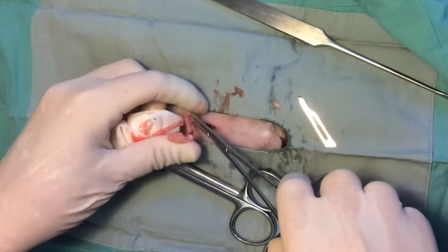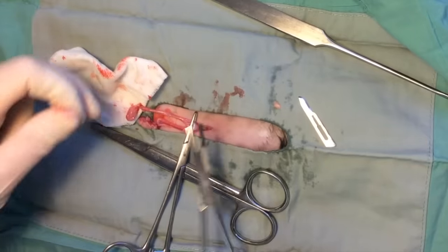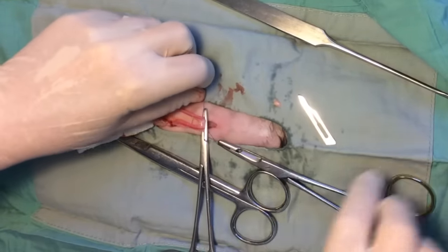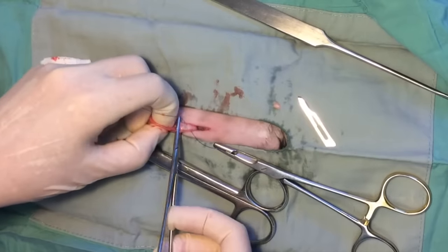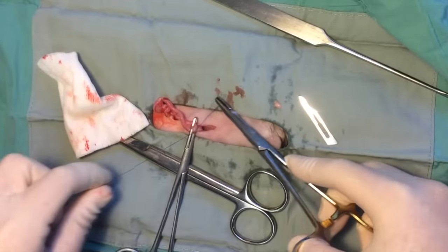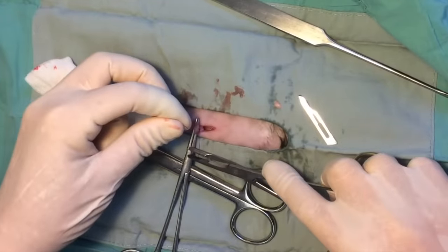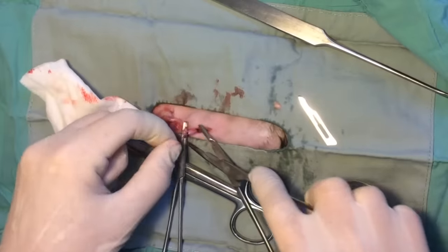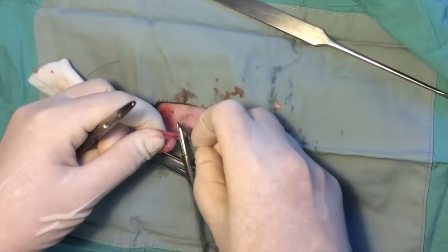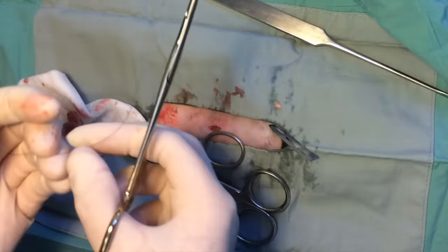The remainder of the broad ligament is broken down to allow the uterus to be fully exteriorized. The uterus is fully extended caudally. A clamp is placed to provide traction to keep the uterus from sliding back in. A surgeon's knot is tied using 4-0 monofilament absorbable suture and at least 4 square knot throws are placed. The uterus is sharply transected distal to the clamp and the uterine stump is released into the abdomen.